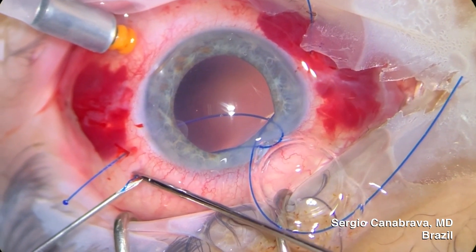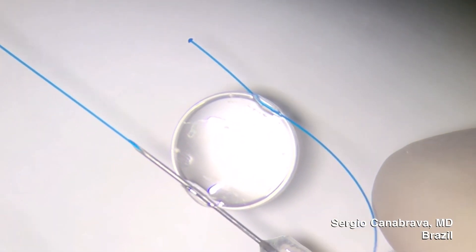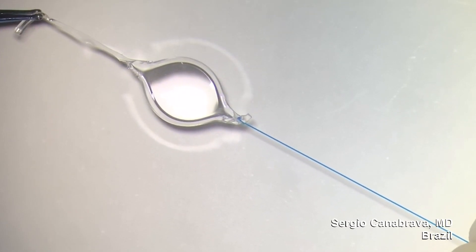In this video, we are going to talk about the tests we've performed of the four-flange technique on a horizontal axis and the results with the Acreos IOL.